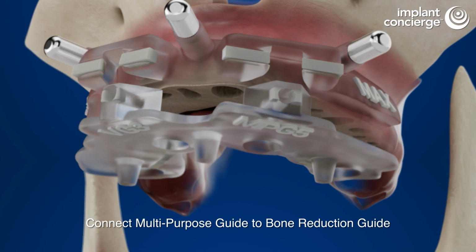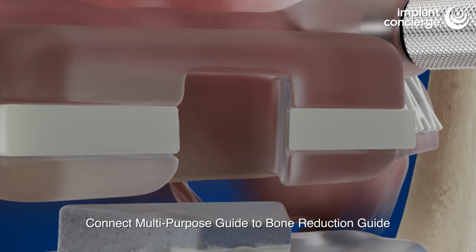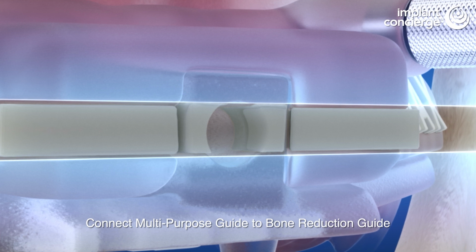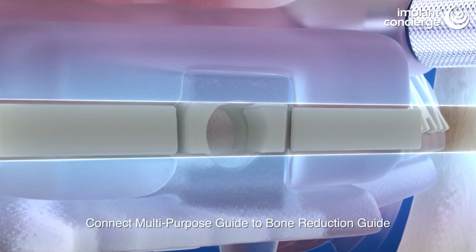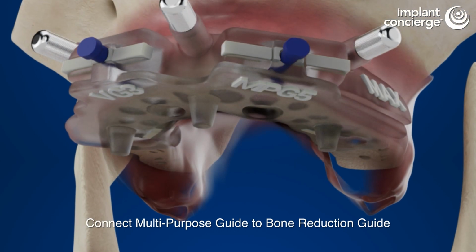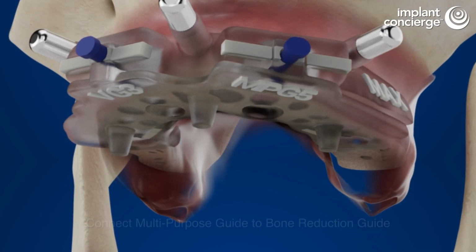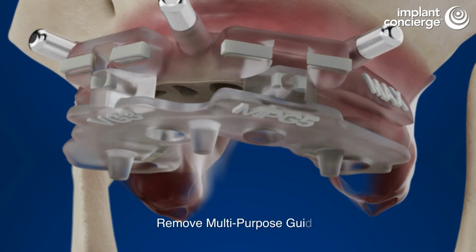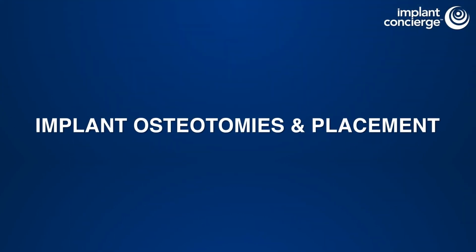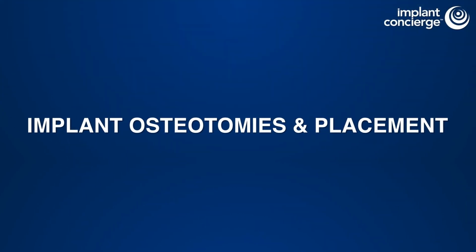Attach the multi-purpose guide to the bone reduction guide, confirming indicator line alignment. If not aligned, it may be necessary to perform additional alveoloplasty. Secure the guides together using the blue pins. When proper fit is achieved, remove the blue pins and the multi-purpose guide. It is now time to create osteotomies and place the implants.